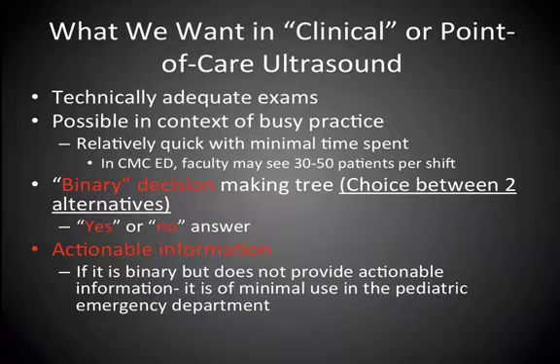In other words, we need to be able to get the machine in the room, set it up, do the exam, obtain the images in a minimal amount of time, and the images have to be good enough to make a decision based on those images. Now, in the emergency department where I work, I'll see perhaps 30 patients a day on a slow day and 50 or more patients on a busy day. So that allows me very little time to get in and do the exam and obtain the images. We also want an image that gives us a binary decision, a yes or no answer.